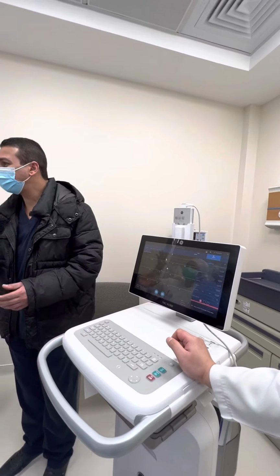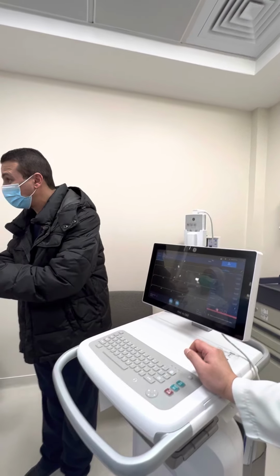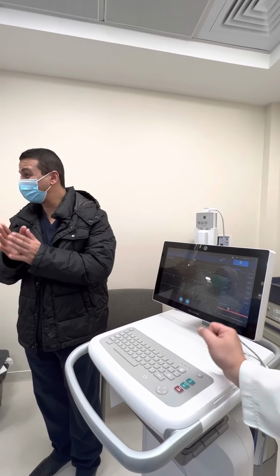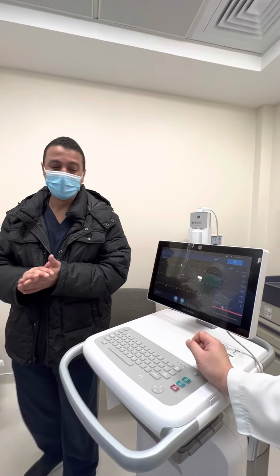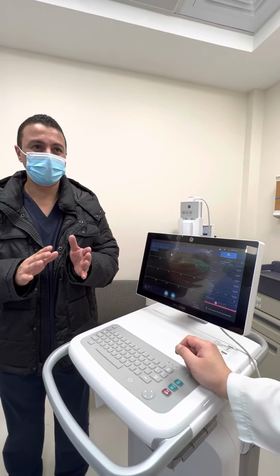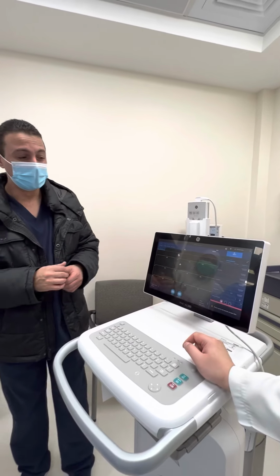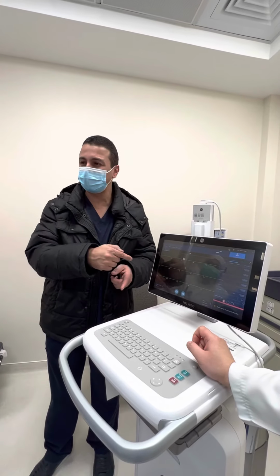The file manager, the files here: we developed the machine to take up to 1,000 reports. For how long can it stay in the memory? It's not auto-deleted. You have to delete manually. Okay. So later on, I will fix the machine now.